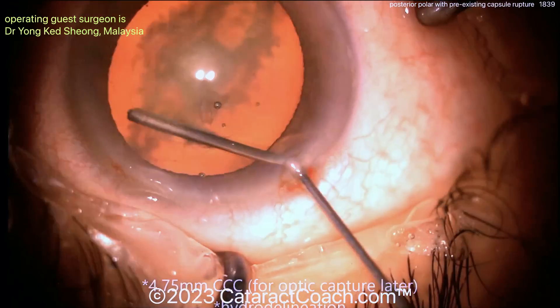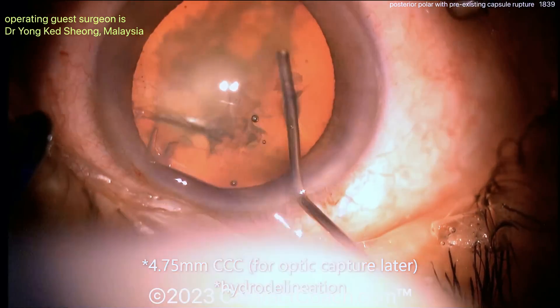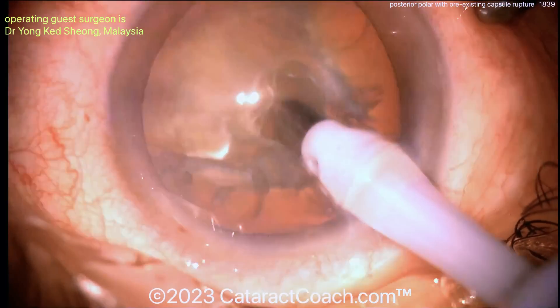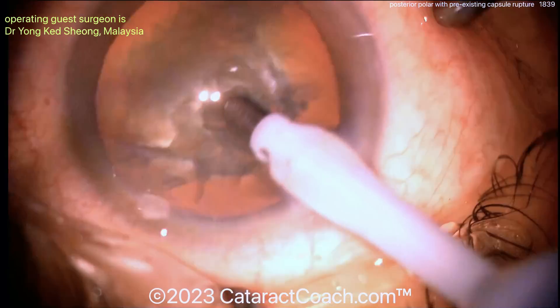Get a good rhexis — you're going to need it. Don't do any hydrodissection. A little delineation would be okay, but no hydrodissection. You can see it going with a phaco probe making a little bit of a pit.